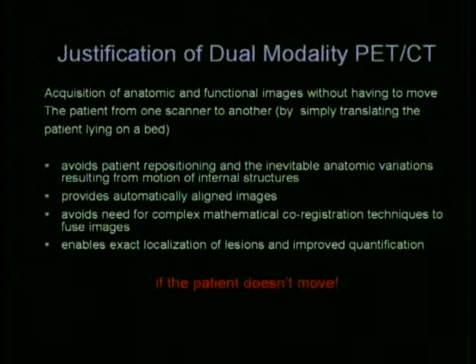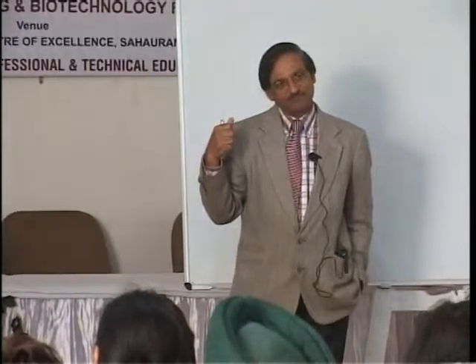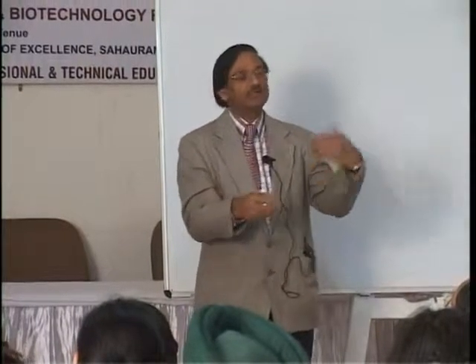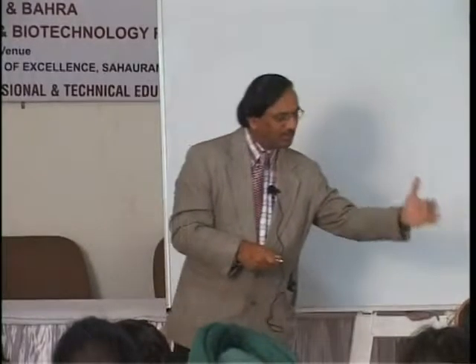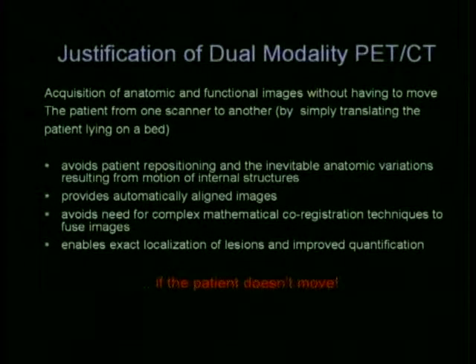The justification here is in dual modality imaging. Suppose you are doing a PET study today and you simultaneously acquire the CT, you don't have to move the patient from one scanner to another, so you save time. The patient can be very sick or incapacitated, and shifting from one imaging modality to another may be difficult. So you can have both pieces of information together in one scanner.